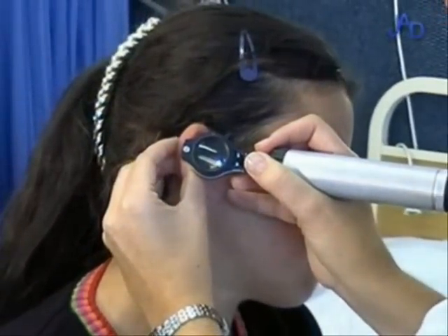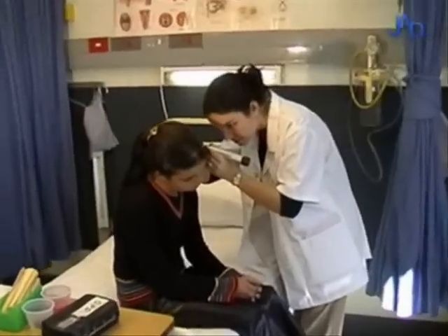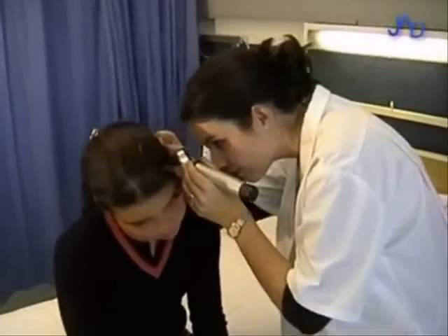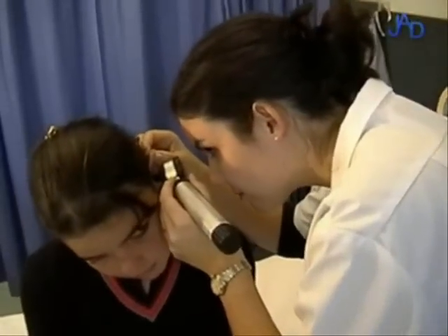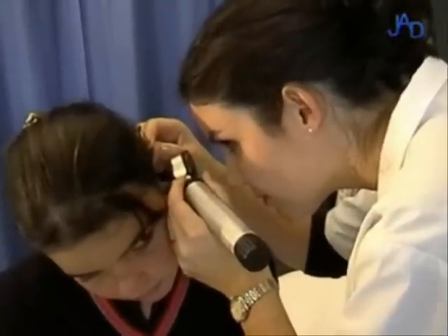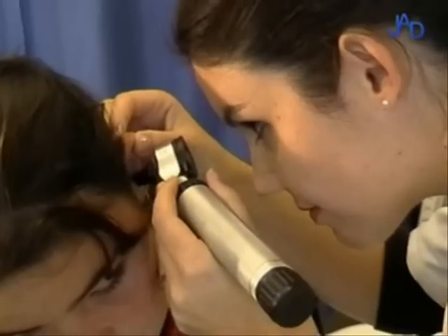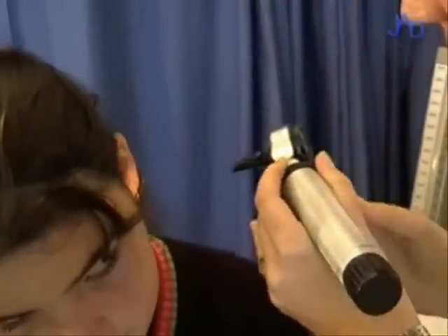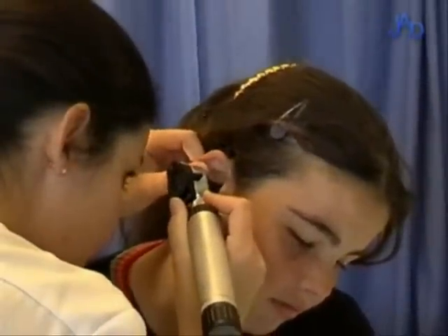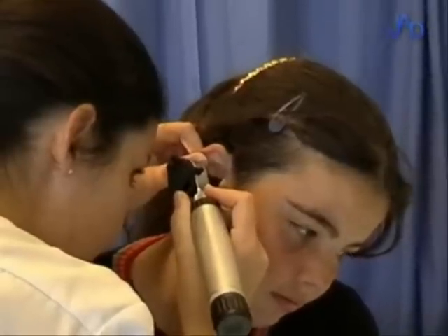The otoscope is used to look inside the external ear canal. The eardrum, separating the external and middle ear, is visualized. The middle ear including the auditory bones can be seen through the semi-translucent eardrum. The examiner takes time to inspect the external ear canal and the eardrum as well as the adjacent middle ear.